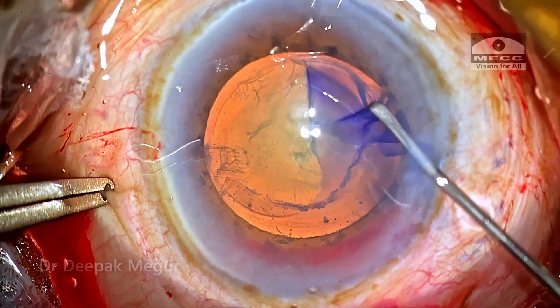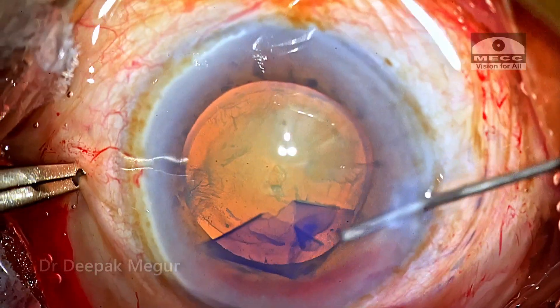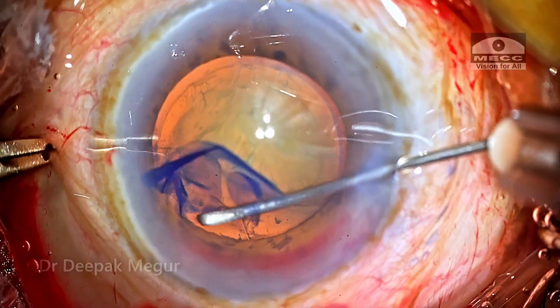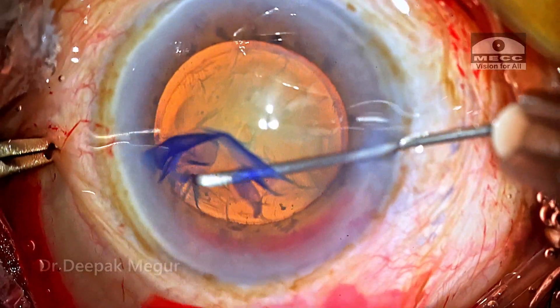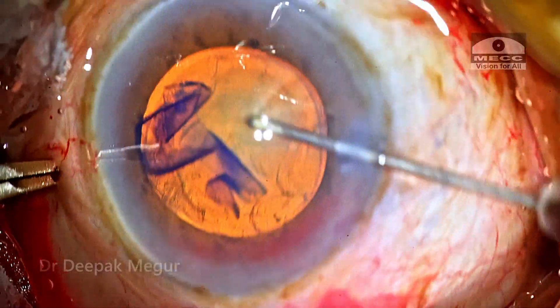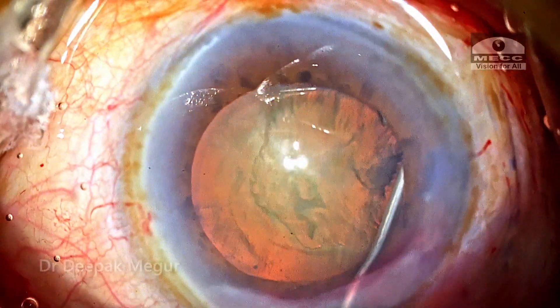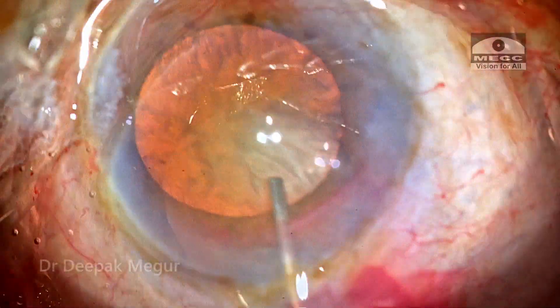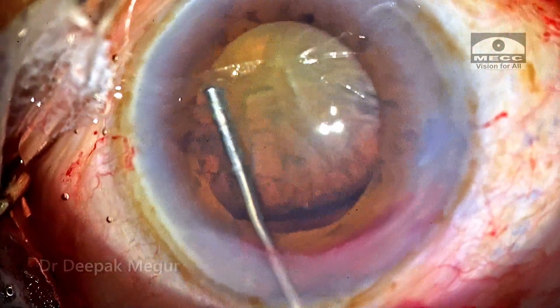It turns out to be slightly bigger than what I intended to have. Nevertheless, it's alright. Hydro dissection is performed and nuclear mobility is confirmed.